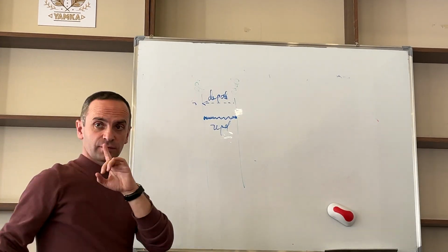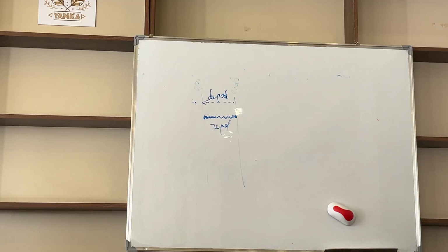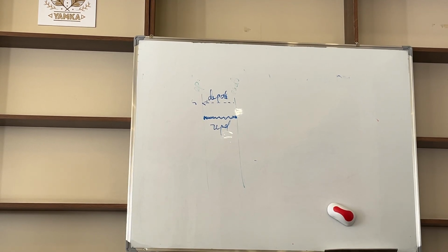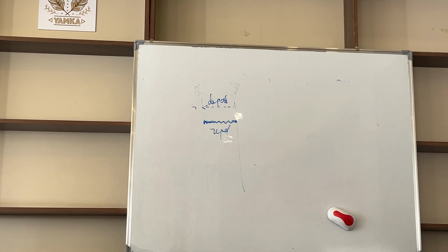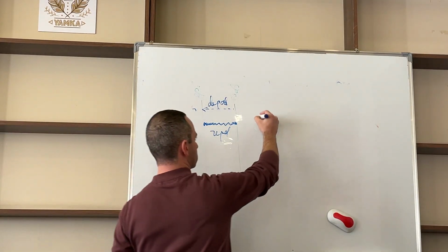And third rule states the vector of repolarization is smaller, or less in size, and is slower. So smaller and slower.